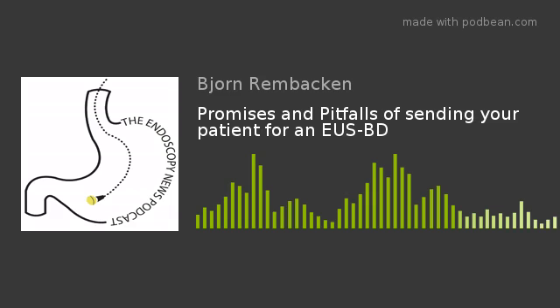So the advantages of EUS-guided biliary drainage is that it's a single step procedure. It can often be done under sedation. It can often be done extremely quickly. So whereas a PTC might take in the realm of an hour or more, EUS-guided biliary drainage from start to finish can be done in about 10 minutes.